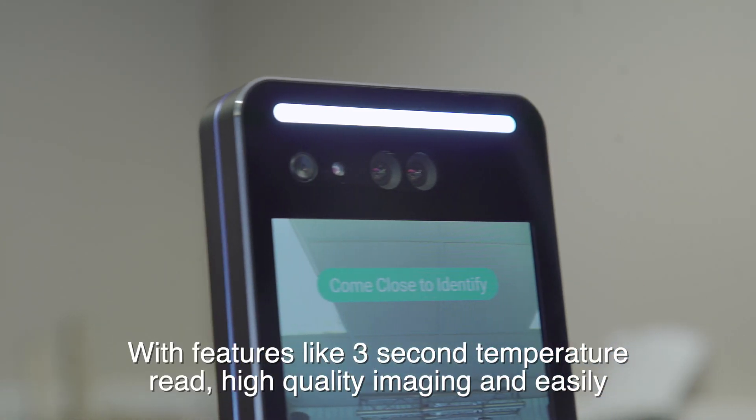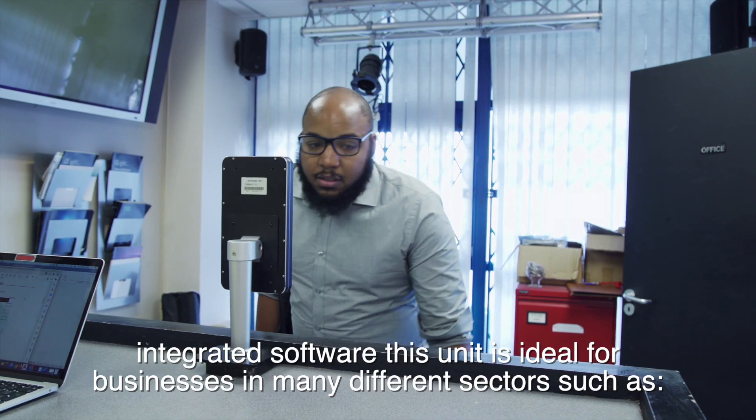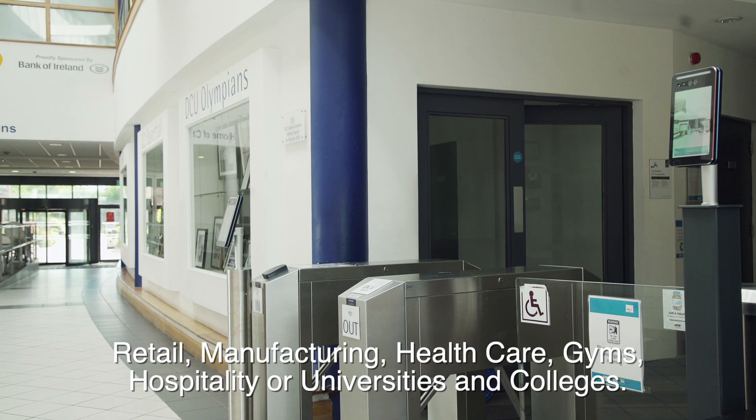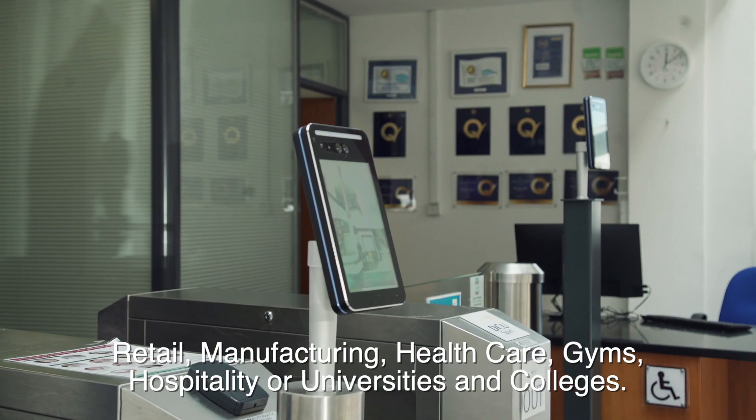With features like three-second temperature read, high-quality imaging and easily integrated software, this unit is ideal for businesses in many different sectors such as retail, manufacturing, healthcare, gyms, hospitality or universities and colleges.